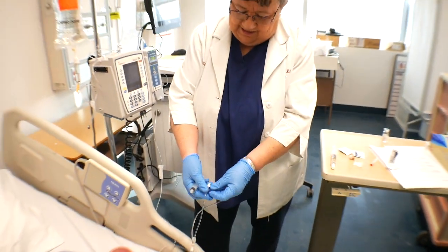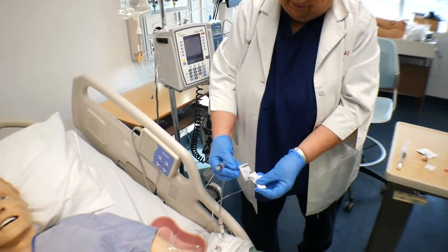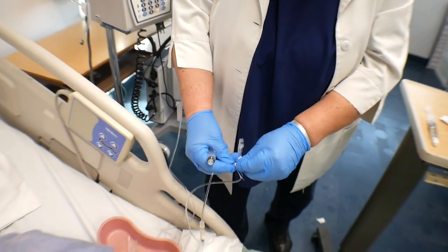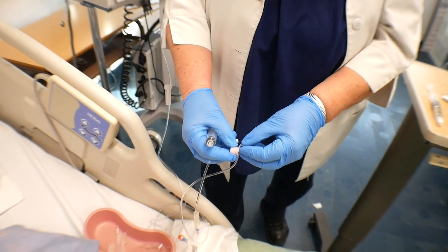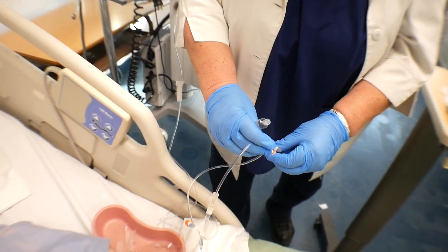So I'm going to just take this off. Then I can clean it again and put the orange cap on it. And then let it continue to run at this rate so that it goes in.